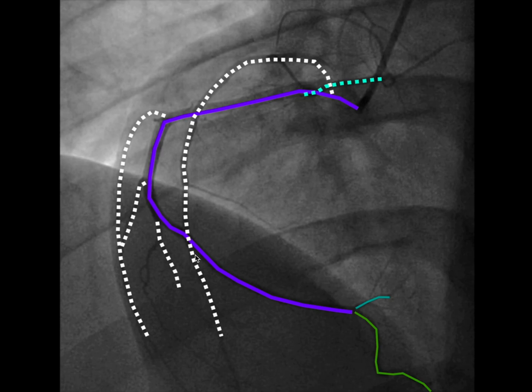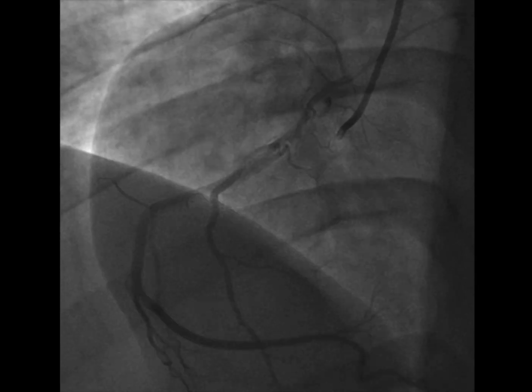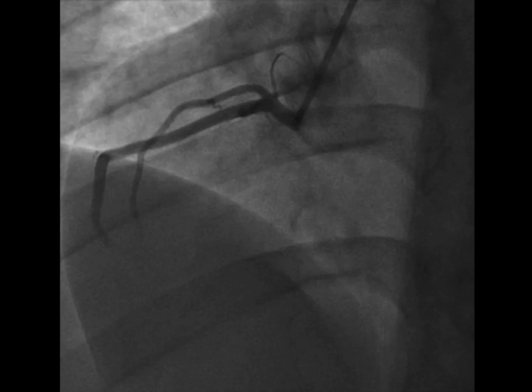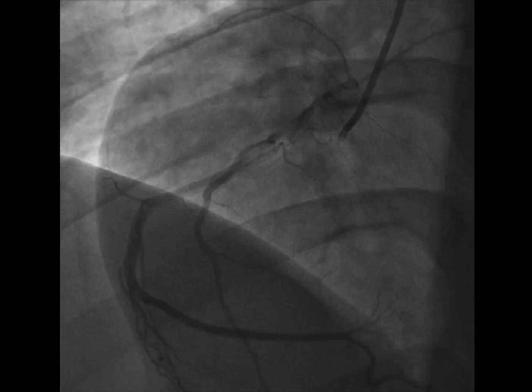So this must be completely occluded by thrombus and probably responsible for most of what we saw on the ECG with that large area of blood supply that's no longer going to the RV marginal. So keep that vessel in mind. I'll play this through one more time at slow motion to allow you to see the old angiogram, and then we'll look back at the modern day angiogram and you'll see that that big RV marginal branch is totally missing.